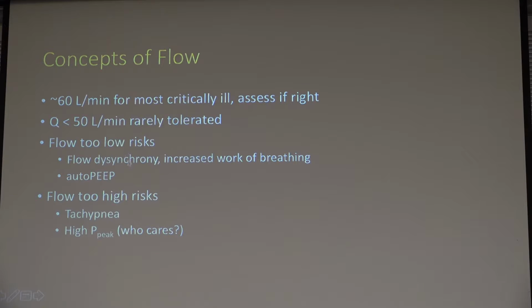If flow is too low, again, that's flow dysynchrony that develops, and that's going to result in increased work of breathing and the potential of auto-PEEP as well. As inspiratory time is increased with low flows, then you have less time to exhale, and the potential for auto-PEEP is certainly there as well. If you set the flow too high, that can actually result in tachypnea. When I talked about work of breathing a long time ago, there's stretch receptors and flow receptors, and if the flow is set too high, some patients will actually develop tachypnea.